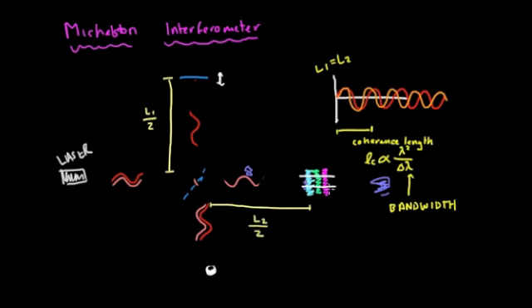So we're looking at the reflection pattern of each of these layers, and then we can move it over and do the same thing over here and the same thing over here, and eventually we have a full cross section that we saw in the beginning of the retina. So I hope this helps you understand a little bit about how OCT is working to determine a cross-sectional view of the tissue.